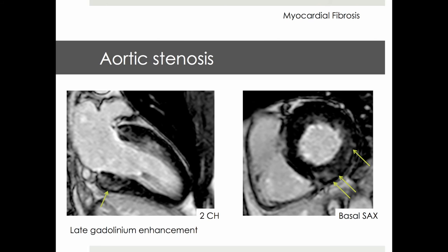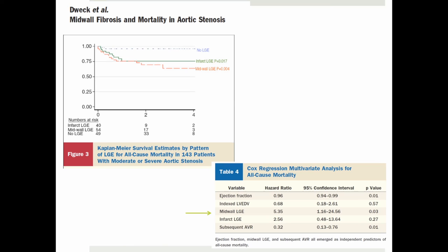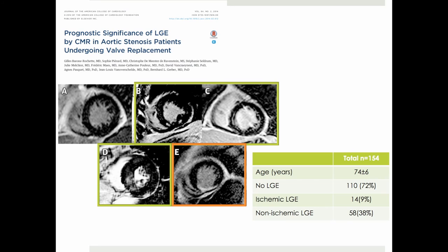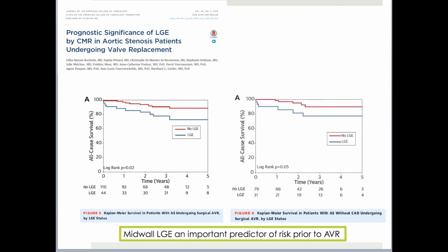In severe aortic stenosis, the predominant pattern of late gadolinium enhancement is non-ischemic, visualized as intramyocardial or mid-wall late gadolinium enhancement with predilection site to basal segments. As shown in this observational study of patients with severe aortic stenosis, this finding is important as it is predictive of all-cause mortality, together with reduced ejection fraction and subsequent aortic valve replacement surgery. This finding was reproduced in a later study in patients undergoing valve replacement, showing that the presence of late gadolinium enhancement, and non-ischemic type in particular, was predictive of a poorer post-operative outcome, identifying mid-wall late gadolinium enhancement as an important stratifier of patients undergoing aortic valve replacement.